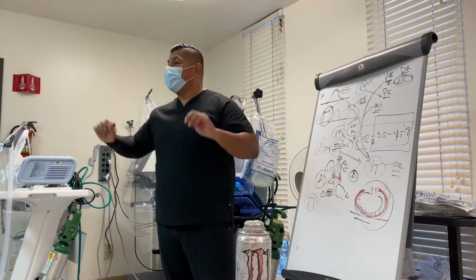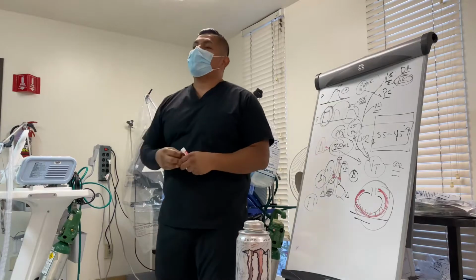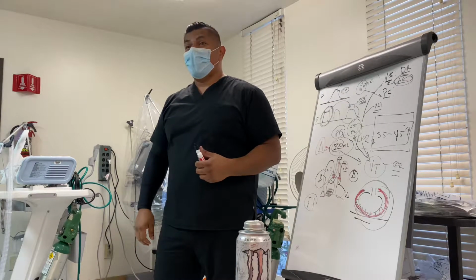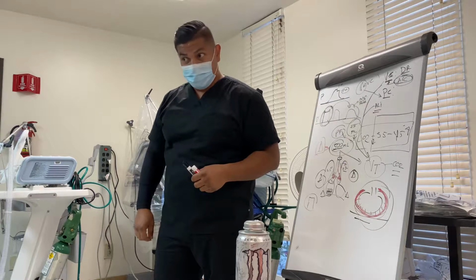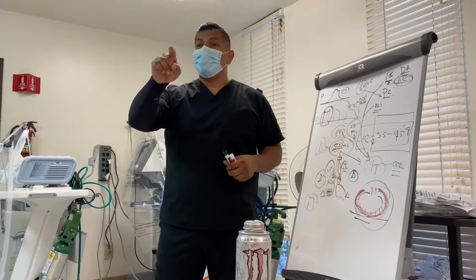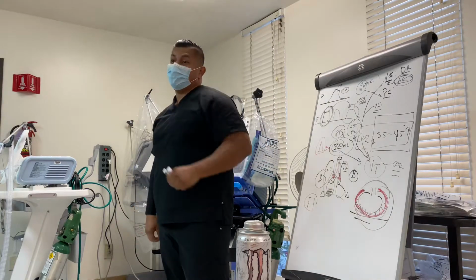That's all they care about, right? I don't care. What's the blood gas? What is the CO2? I don't care how you got it in there. Do you think they asked for peak pressures? No. What's the result? It is your responsibility to know what the peak pressures are because you're dealing with it.